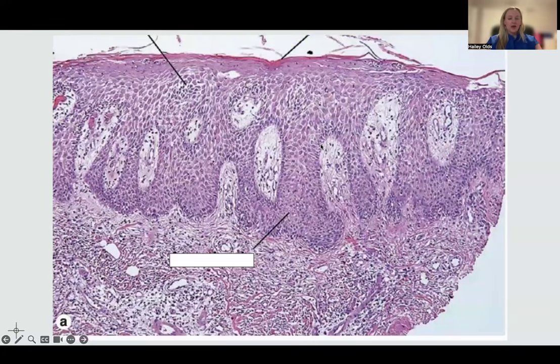Great. Okay, now we are shifting gears into the rash category. So this is a broad kind of rash. I'll let you think about it.